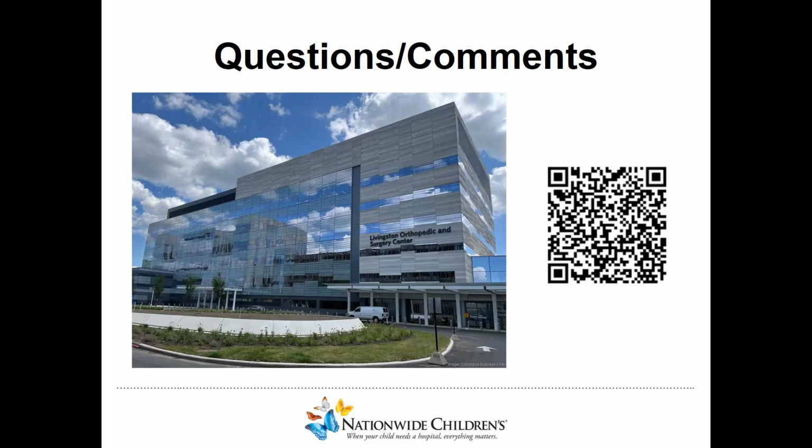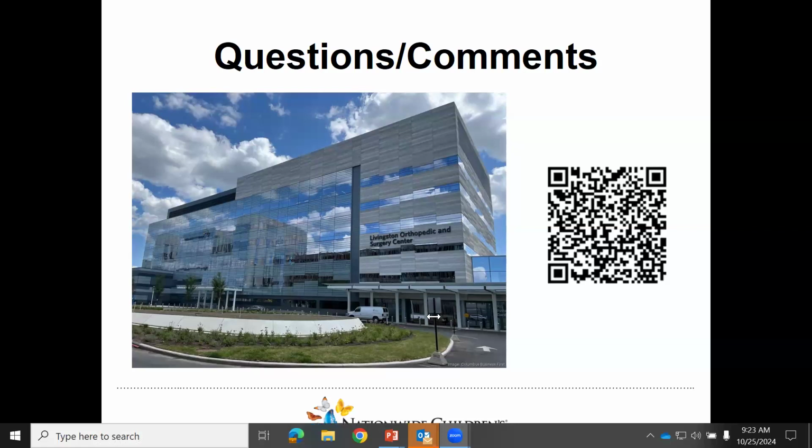The other is that occasionally you can actually get a lipohemarthrosis as well, which is going to give you a triple layer sign on that suprapatellar recess effusion, and that's going to be indicative that you may additionally have a fracture associated with it, which obviously in some cases you can get with these patellar dislocations. And typically with that triple layer sign, what you're going to see is that the bloody layer is going to be deepest, then you'll get the synovial layer in the middle, and then the adipose layer, which is going to be most superficial at that area.